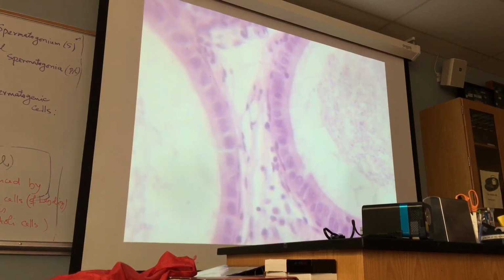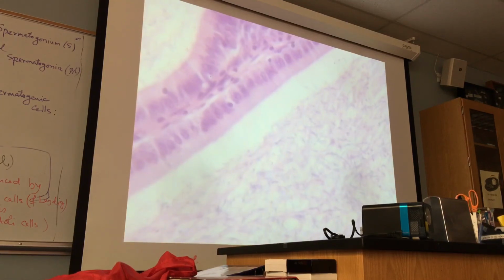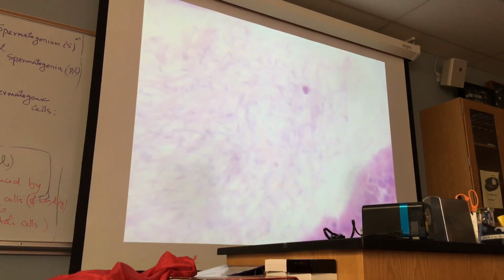Okay? Millions of sperm cells. These are sperm cells. Okay?